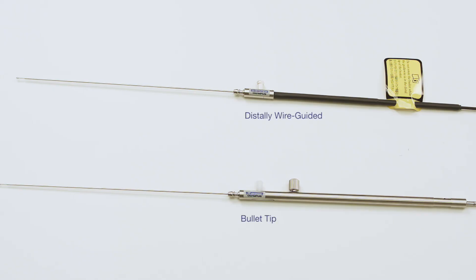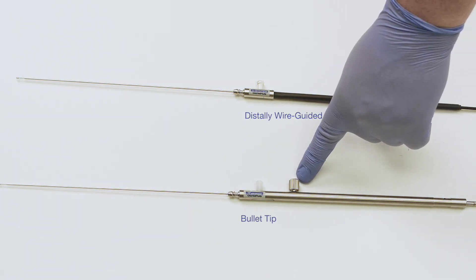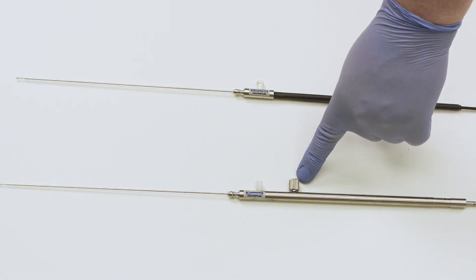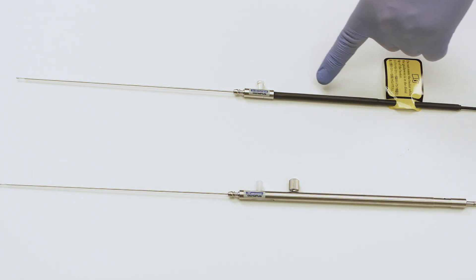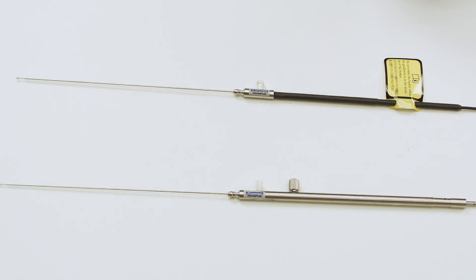There are also differences between the distally wire guided and bullet tip versions at the proximal end of the basket. The bullet tip version has the locking knob used to retract the plastic sheath. The distally wire guided version does not have a locking knob because it does not have a plastic sheath. However, both baskets assemble to the autoclavable handle in the same way.